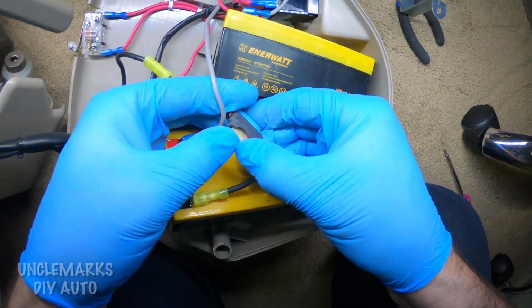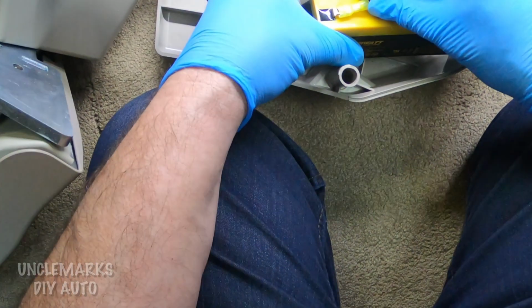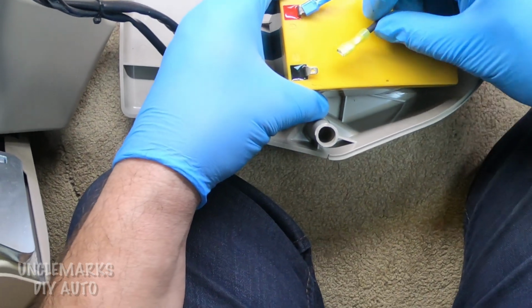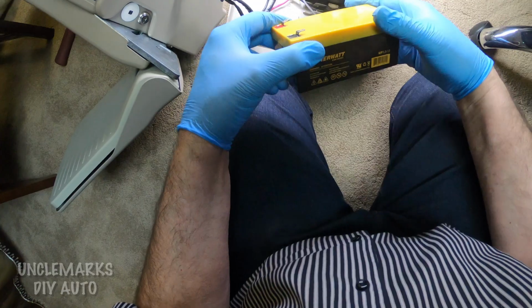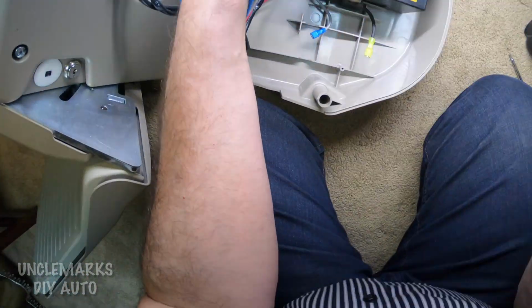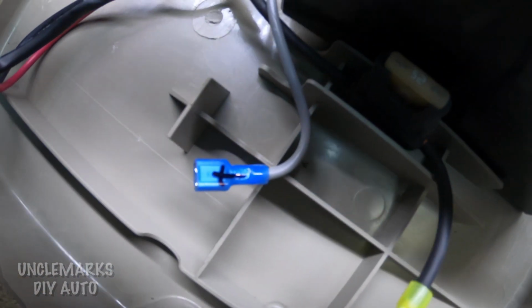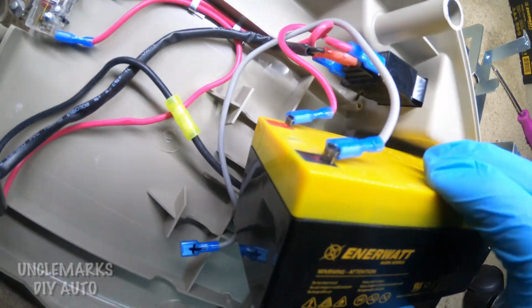Get that back in there. I don't know why it's fighting me. And I'm going to try and take these guys off. You may want to remember where they go. Maybe what I'll do is mark which ones are the positives and which are the negatives. Good thing I've got this video. Later on there I actually wrote them down. That was good of me.